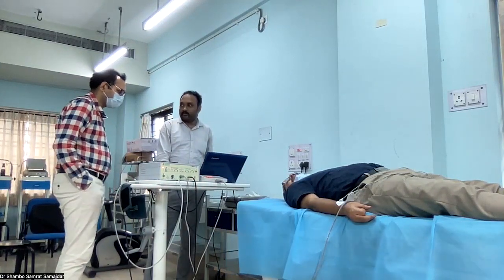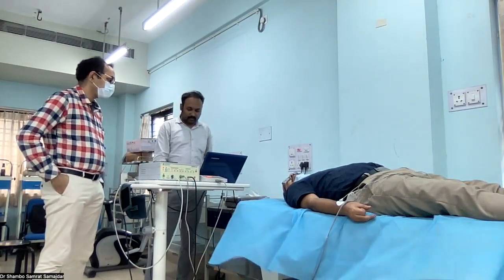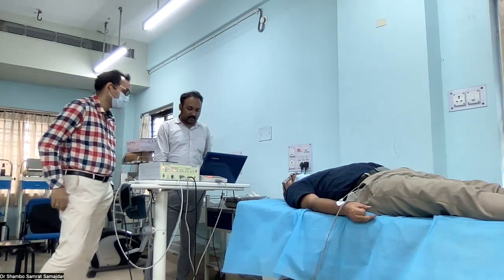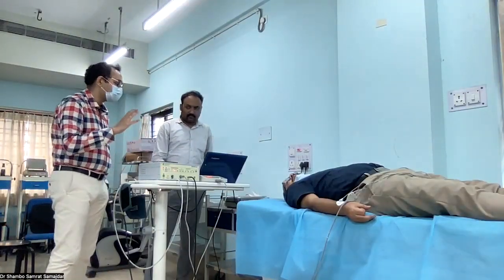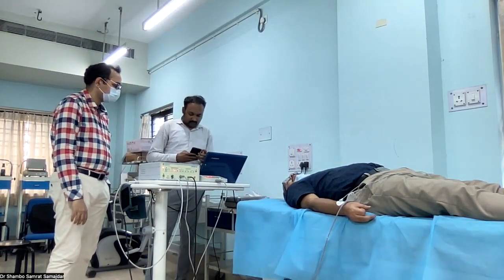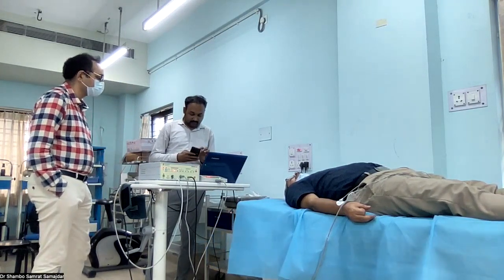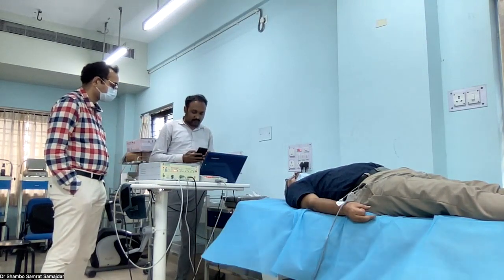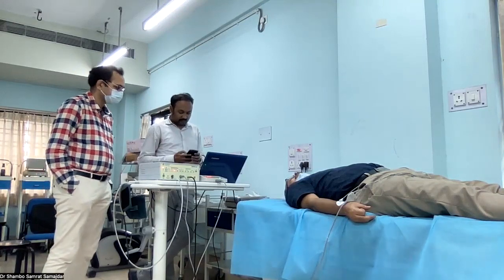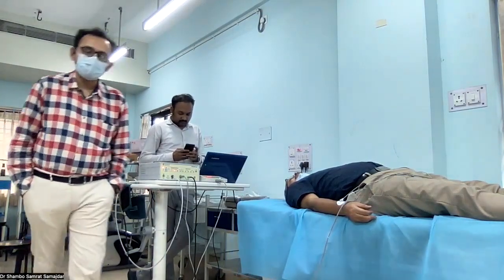Now we will take ECG. At first, we record ECG while the patient is in supine position, and we will take ECG after immediate standing. So let's start. What is the change in the heart rate variability while standing? This test will let us know. At first, we are recording supine position ECG. So we are now recording ECG in supine position. So this will take total 1 minute.